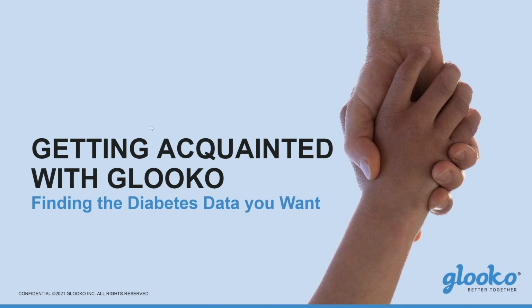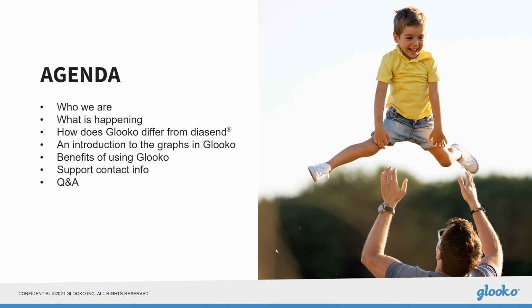As you'll see, we're going to be getting acquainted with Glooko. Today, we're going to cover several things. First of all, we're going to start with who we are. Who is Glooko? What are we trying to achieve? What is happening with this upgrade? Who's it going to affect?